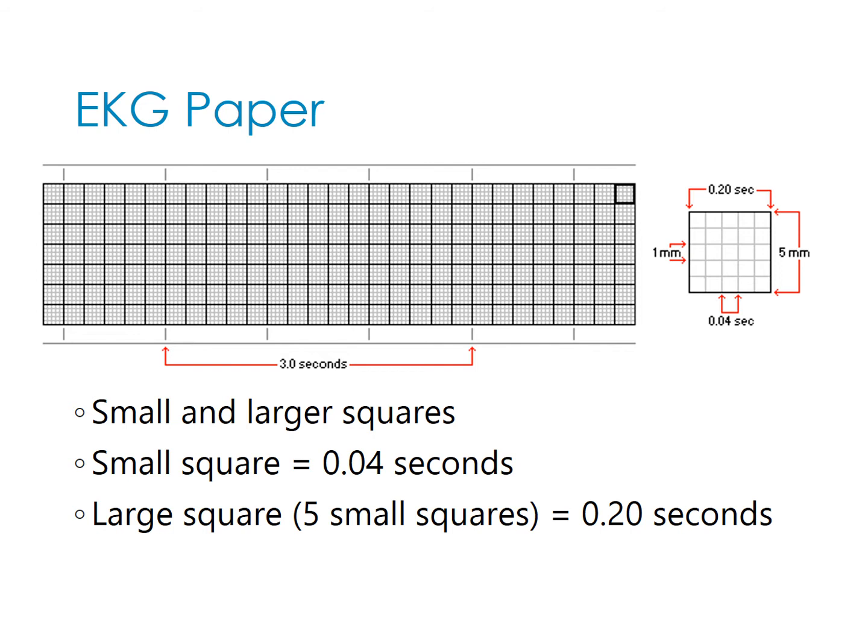your heart is beating. So to determine ventricular rate, you will multiply how many QRS complexes are in a 6-second strip times 10. I'm going to show you some strips here in a minute. This probably doesn't make much sense yet, but let's say we count 4 QRS waves in a 6-second strip. If we have 4 QRS waves times 10, that would be 40. Again, that's just an estimate, but that gives us a decent idea about how fast that heart is beating.